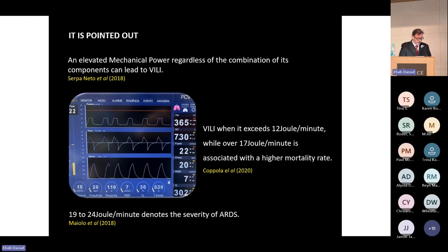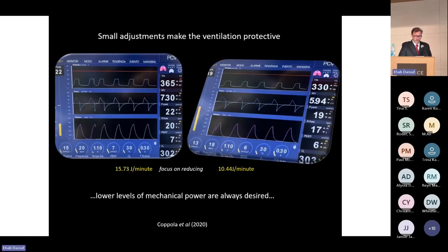However, doubts persist about the safer adjustments of mechanical ventilation components and parameters in ARDS to attenuate VILI. So, small adjustments make the ventilation protective.